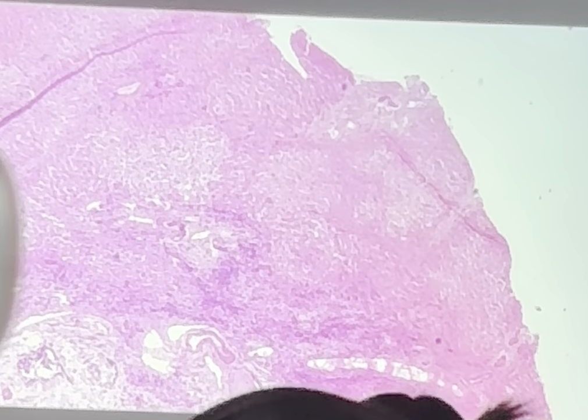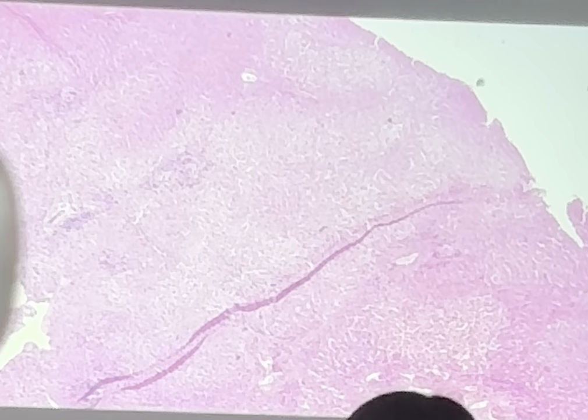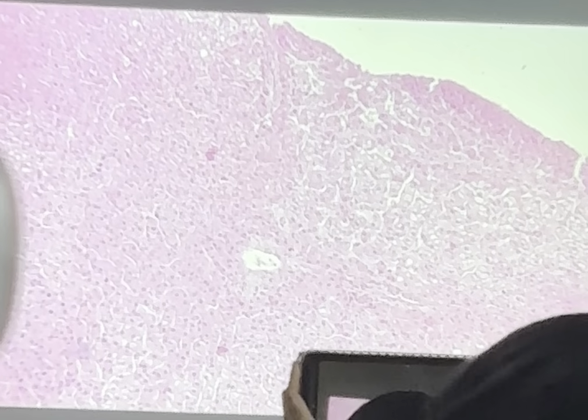This one, it's a little complicated, but I just want you to differentiate the normal compared to the abnormal. Okay? So let's somewhat look at the normal first. Not exactly normal. Do you know what organ this is? What's that in the middle?